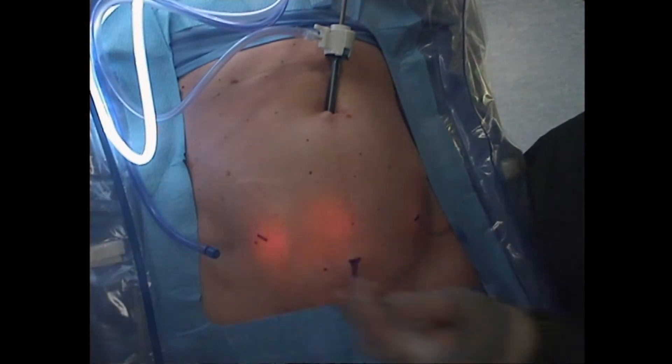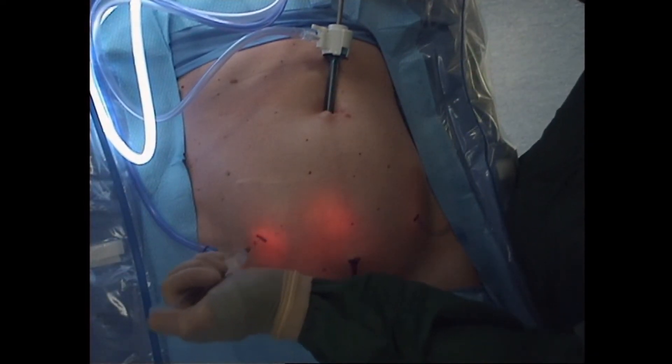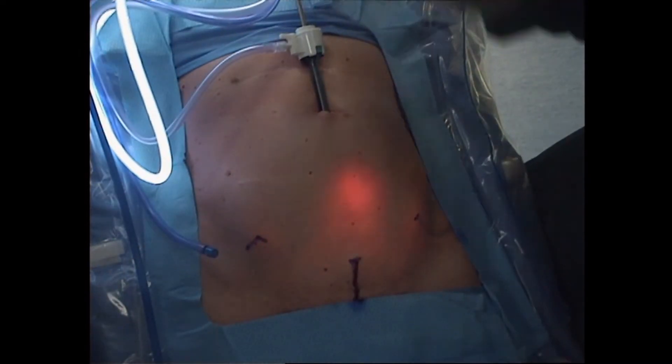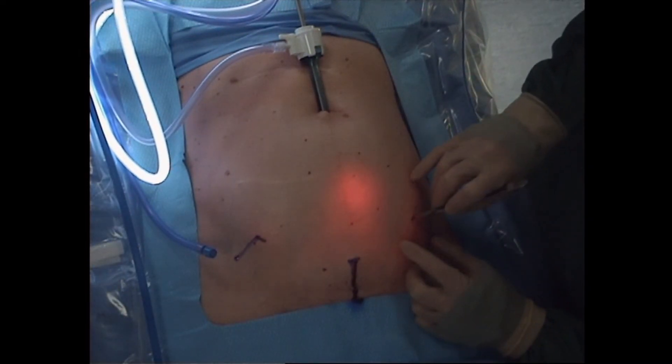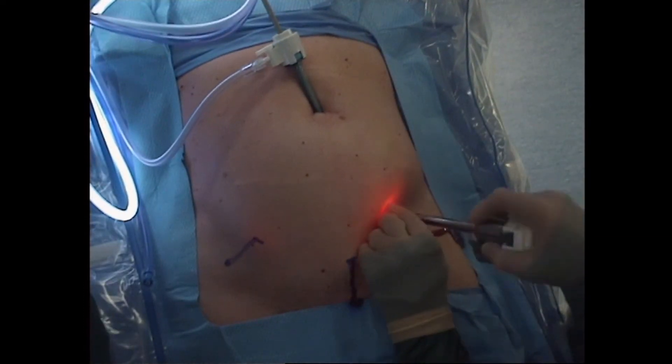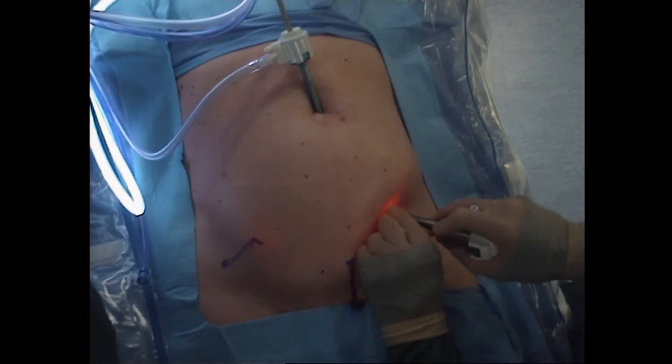8-millimeter incisions are made at each mark, followed by trocar placement—in the right lower quadrant and left lower quadrant, verifying that I am lateral to the rectus sheath, and in the suprapubic region, verifying that I have cleared the bladder edge.